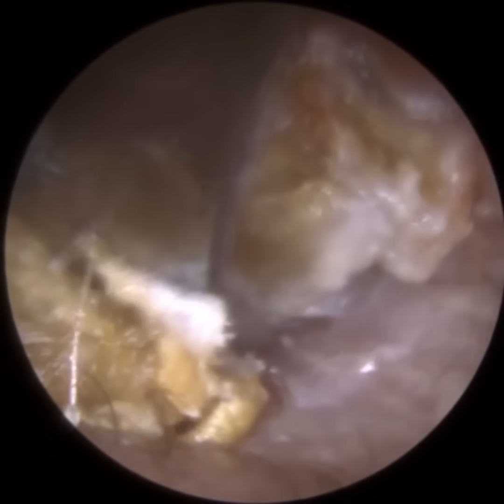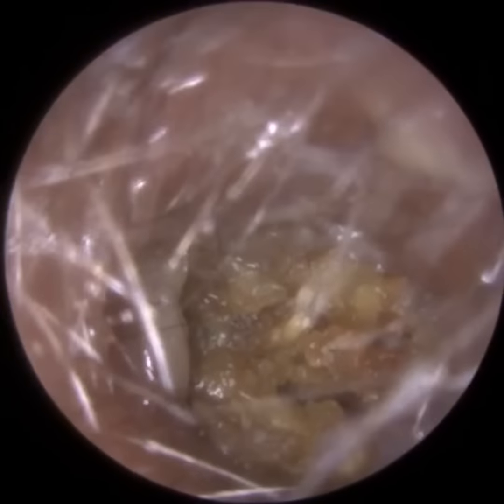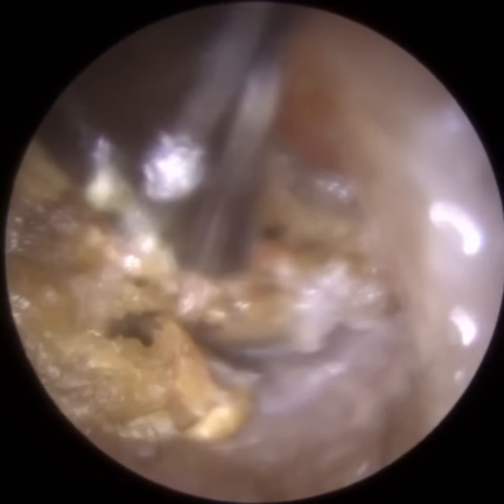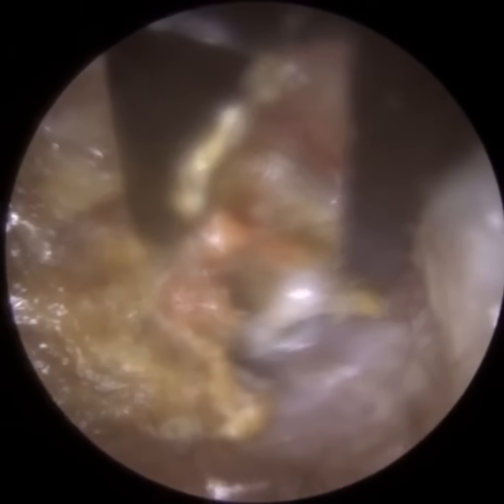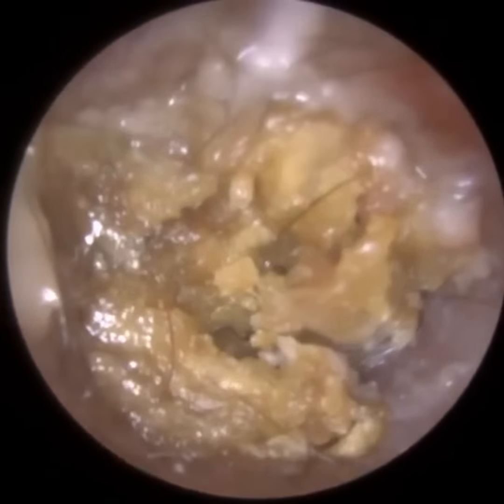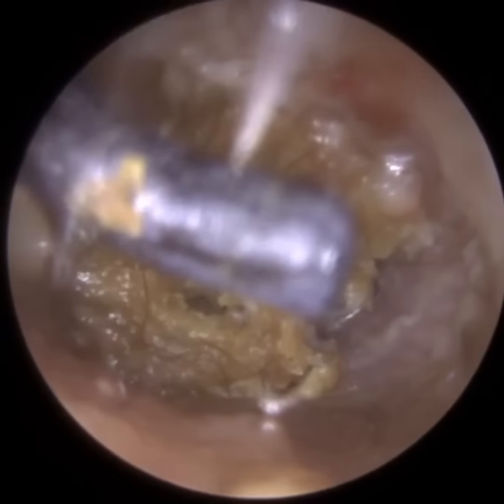So I've just gone in with the fine jaw crocodile forceps. I've managed to get the bottom jaw, the bottom of the plug of skin, so that's why I was lifting up with the suction probe just to make a bit of space there. But because of the consistency of this dead skin, it's soft, it's stretchy, and the forceps are in some way just cutting through. It's not extracting the plug, it's just slicing through it like scissors. So I think I'm going to use some ear hook now.